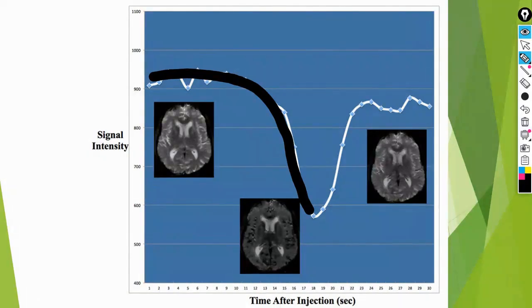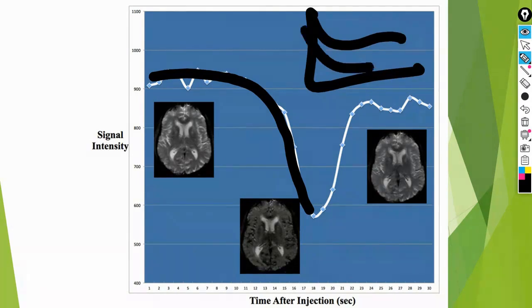The effect of the contrast agent was that it reduced T2, and when it moved away, T2 returned to increase its duration. So my signal started to grow, and it became larger here.